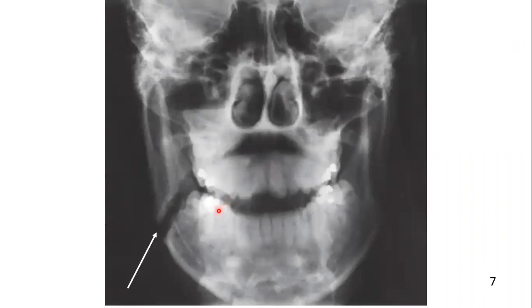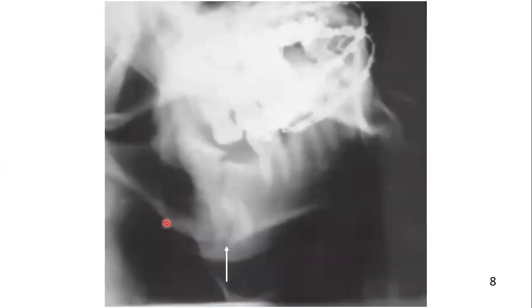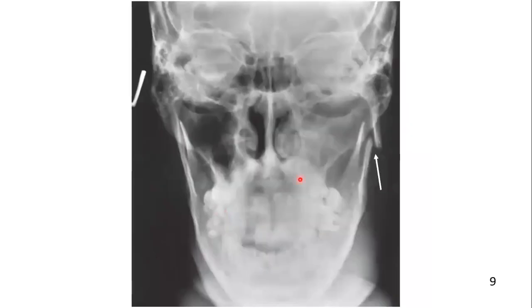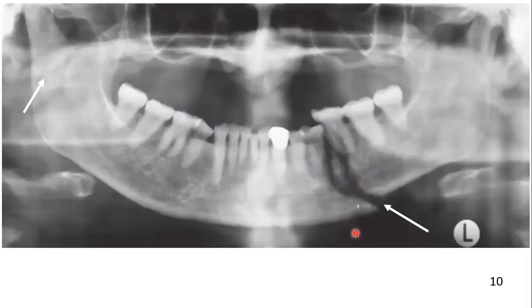Here in this radiographic picture, you can see the posterior-anterior view demonstrating a fracture in the angle area of the mandible. This is a lateral oblique view showing a fracture in the angle area. This is a reverse Towne view showing displacement of the condylar fracture. This panoramic view shows a displaced fracture of the left mandibular body and a right subcondylar fracture.